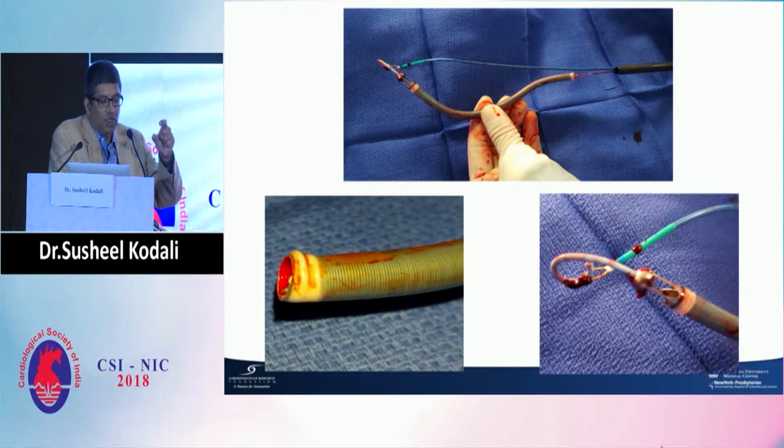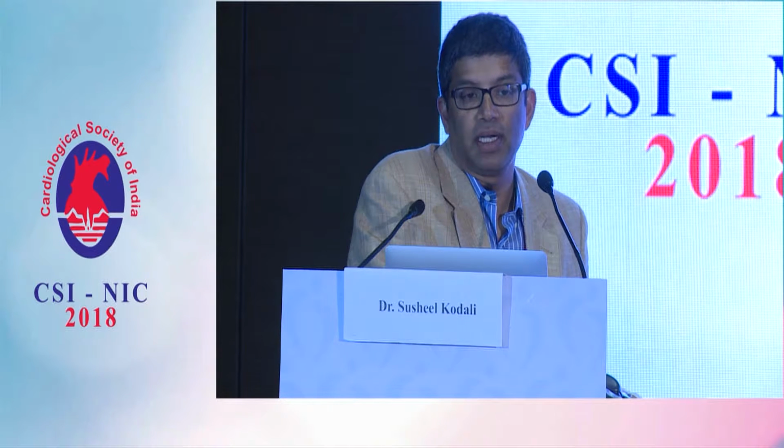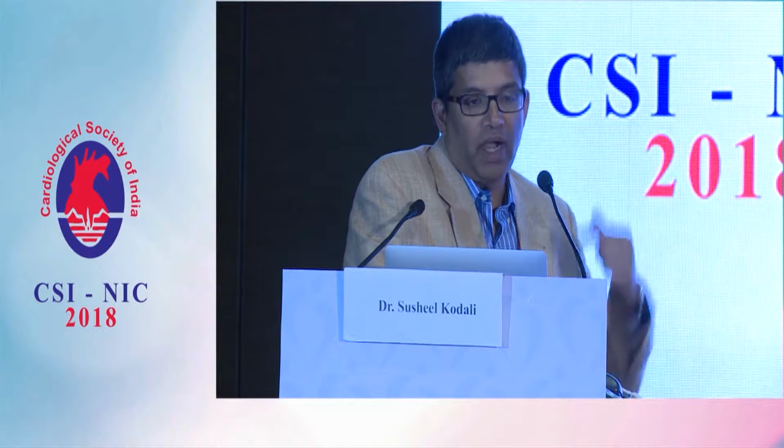No, I think what would have been a better approach, as you suggested, the other side, jugular other side would have been the best. The other side, this thing will kink. So pulling it up and over, that was the concern. No, the stiffness. Catch the pigtail. Once you catch the pigtail and you have a big sheath either in the jugulars or in the femoral, and then pull it down.